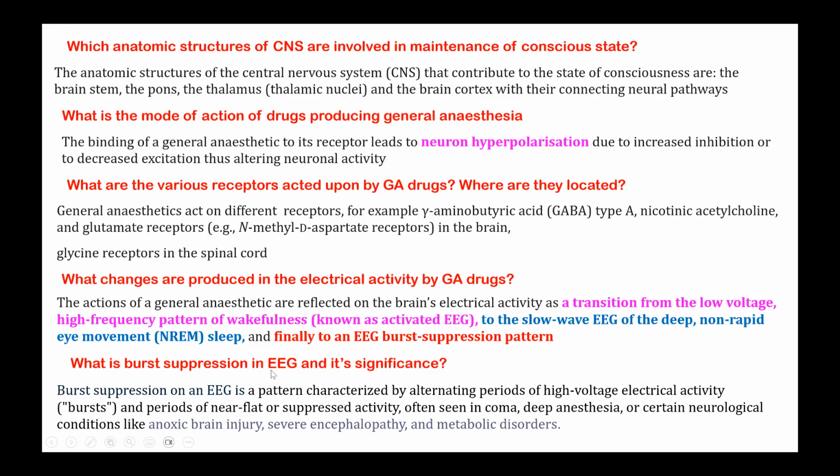Now, why should this burst suppression happen? Any reason for this? Why is this happening in coma or in deep anesthesia? Do you think it's sort of a protective phenomenon?